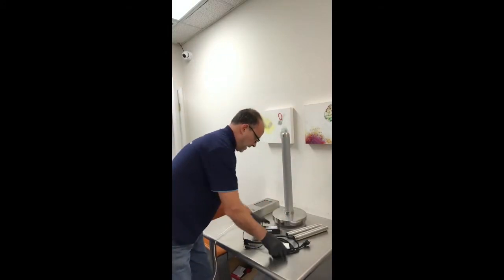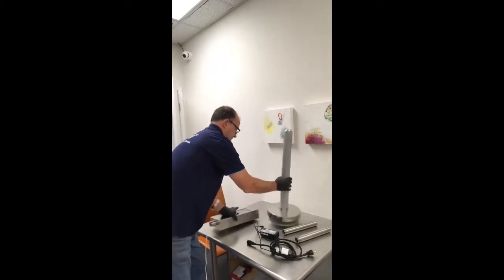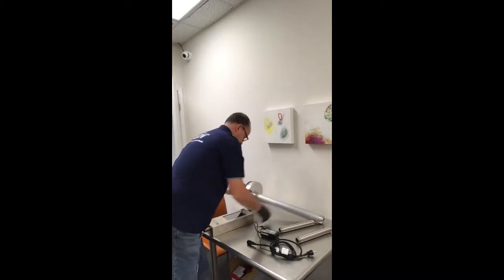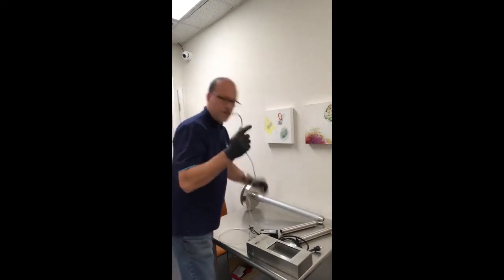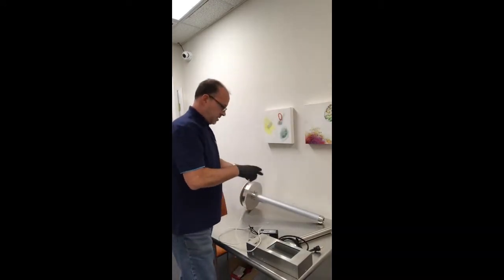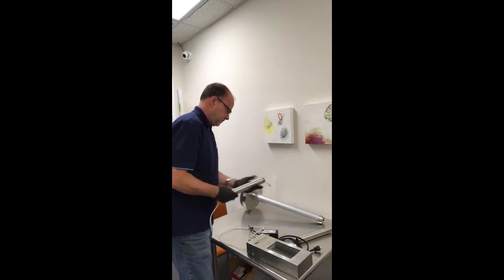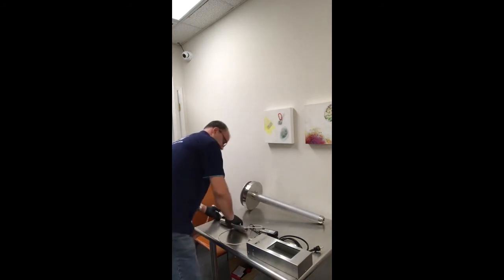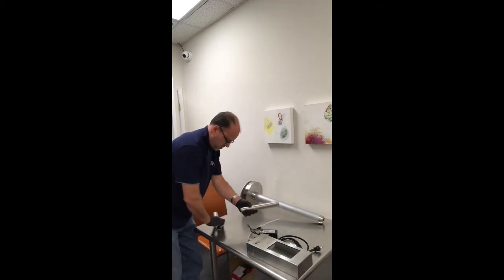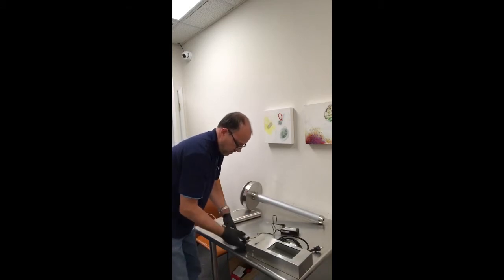We have the two-piece power adapter. The first thing we're going to do is feed the power cable through the mounting poles, then attach our first mounting pole directly to the unit.